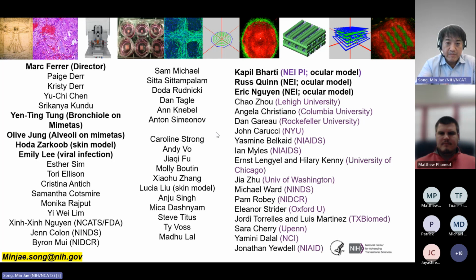Another benefit of biodegradation is that it really helps tissue integrity. What we experience with the commercial transfer membrane is, when you do the histology, after fixation and when you punch them out, they easily separate. That means the integrity of the tissue is weak, and they are barely attached together. But with the PLGA scaffold, they are all tightly together when you punch them out. That's why we try to use the biodegradable scaffold.